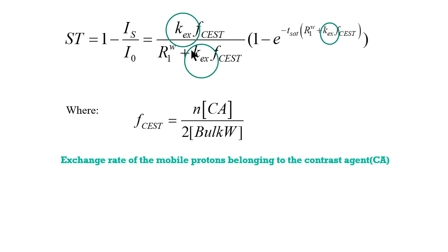I already specified that we have to stay in the slow intermediate regime because we have to avoid extensive broadening of the resonance that would require higher B1 values for the irradiation field and then introduce SAR effects, as well as avoid too fast exchange because it may lead to the coalescence of the exchanging proton signals.